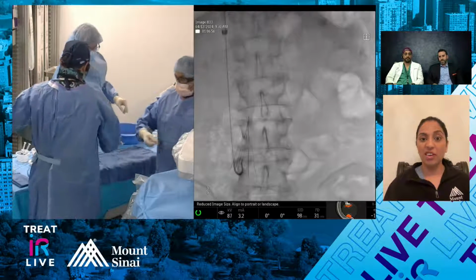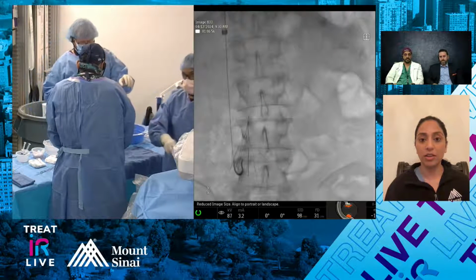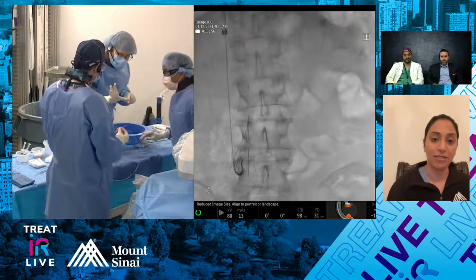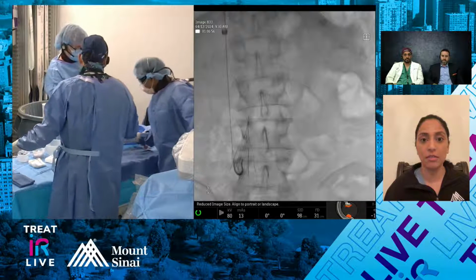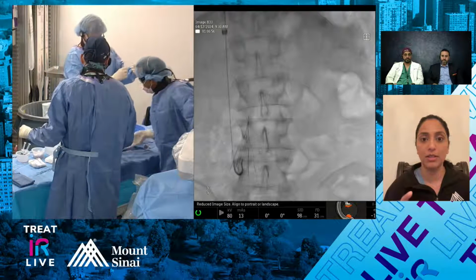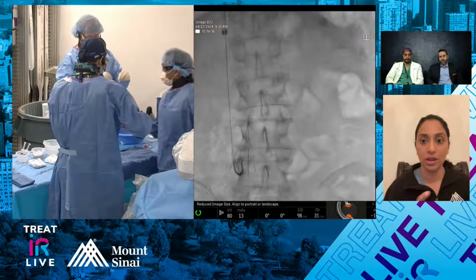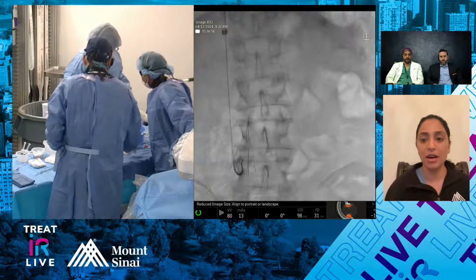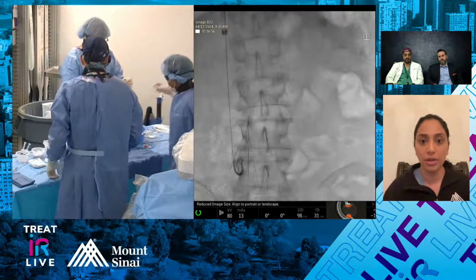I've tried the Protrieve, and it's kind of difficult sometimes because technically you can't really put the forceps through the Protrieve sheath. I mean, you can, but I'm biased. And with the Protrieve sheath, you need at least 5 centimeters of landing zone above the filter for it to actually sit. And the angles are quite different, especially if there's a tilt on the filter towards the left, which commonly there is.